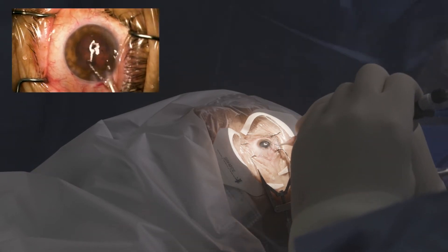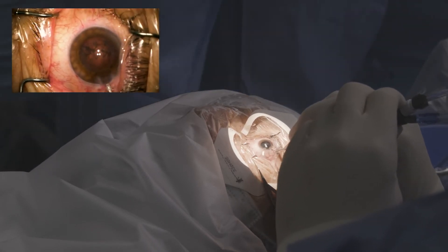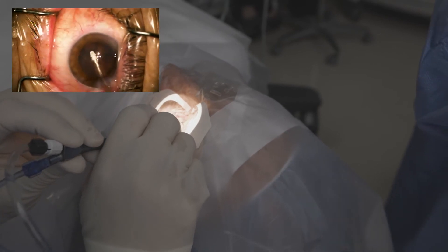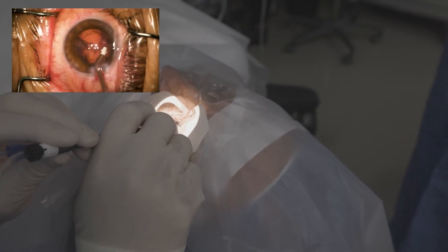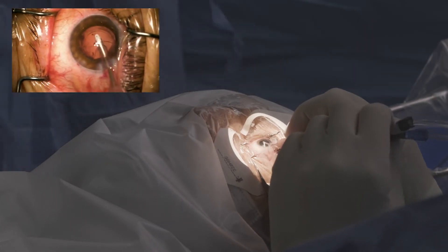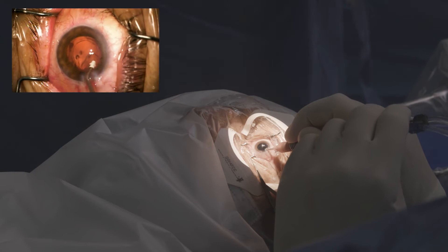The strength of the capsulotomy is actually stronger than a manual one, which also is stronger than a femtosecond-created one, and this has been shown in several studies now. You can see just how easy the cortex is to strip — you don't have to go back after it again. It's not stuck to the undersurface of your capsulotomy like you might see with femtosecond technology.